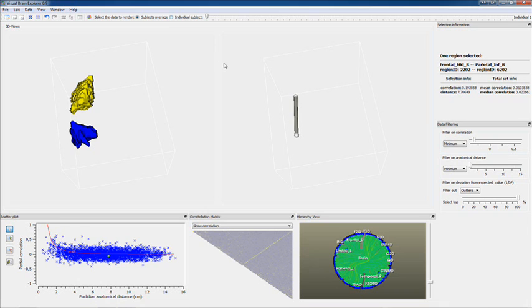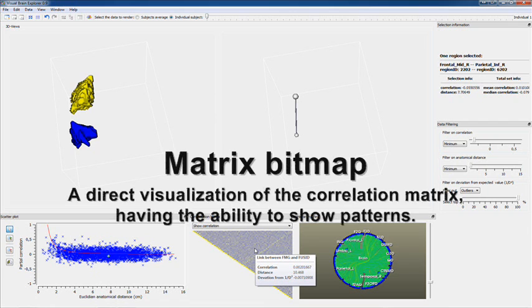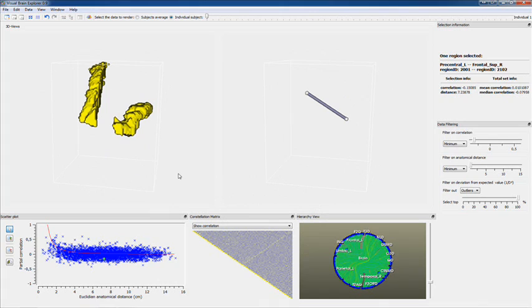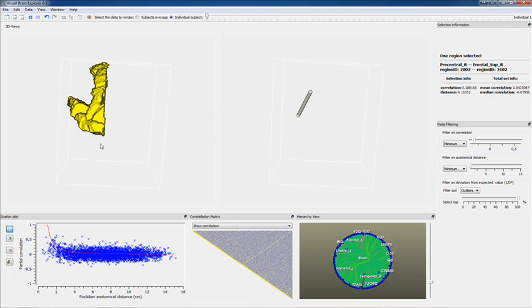Let's go back to an individual subject for a moment. This is the matrix bitmap, which represents a direct visualization of the correlation matrix. There's one region. The other one is mirrored at the end, and it's also mirrored here.